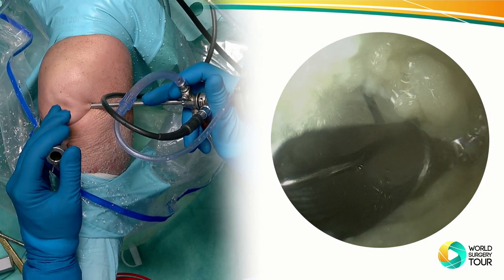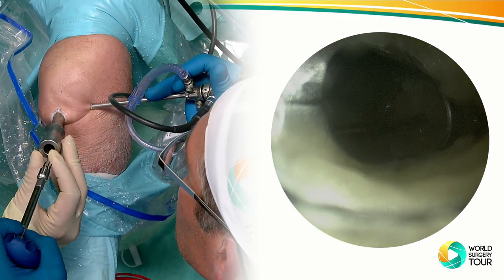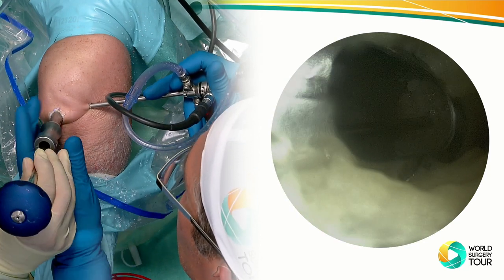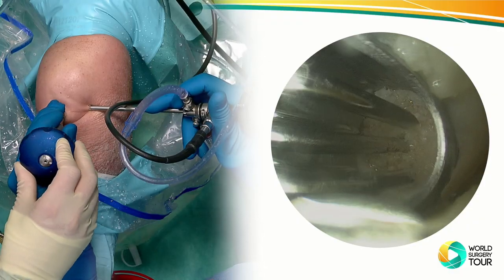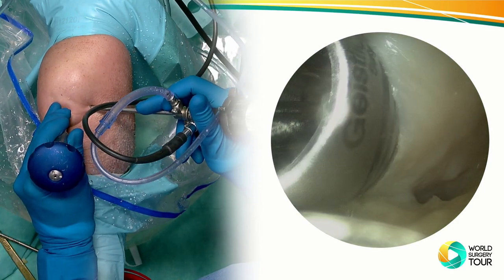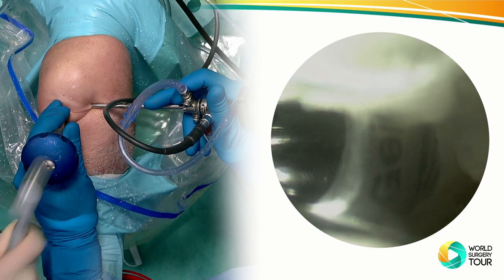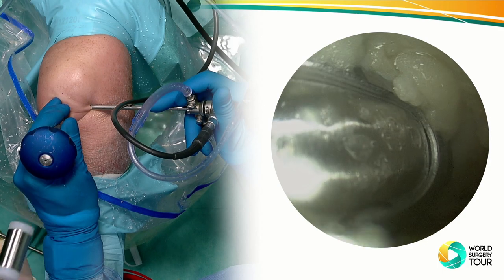I have the microperforator now. I heard you. I cannot see it from the top here. Careful. Wait, let me hold it. Can you see it? Here we go. Okay, so now you're going to move it in. It has a depth penetration stop, so to say. And the nice thing is that it is absolutely standardized. So you have 9 millimeter in depth and 4 millimeter distance in between the wires.